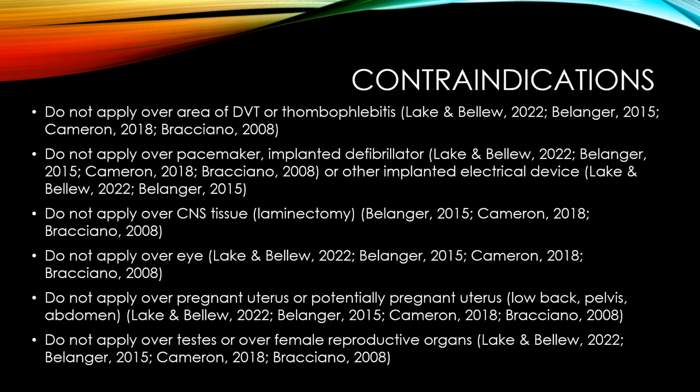Here's some more contraindications. Do not apply therapeutic ultrasound over an area where there is a deep venous thrombosis or thrombophlebitis, because if you apply ultrasound there, you might loosen a blood clot, and if that blood clot then travels to another area of the body, it could create an infarct there, perhaps in the lungs, heart, or brain. That would be a really bad thing.